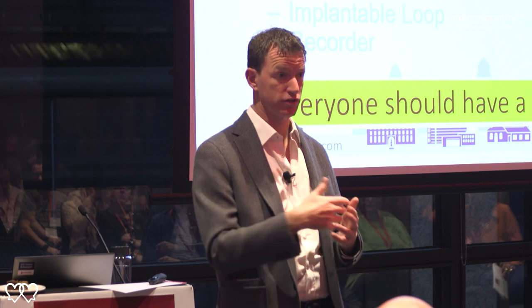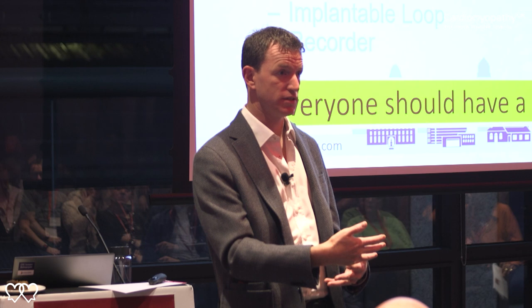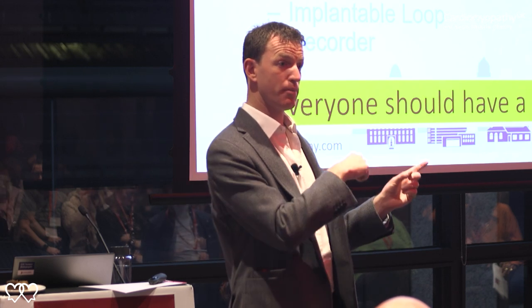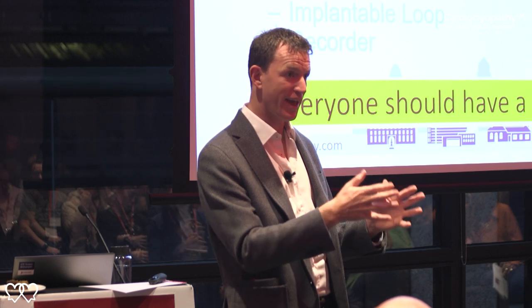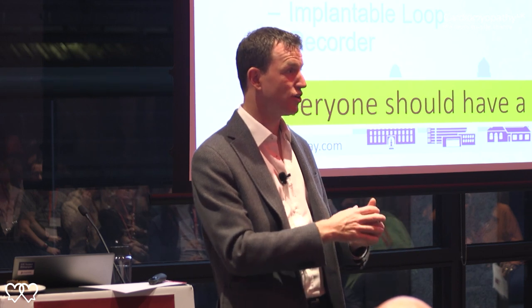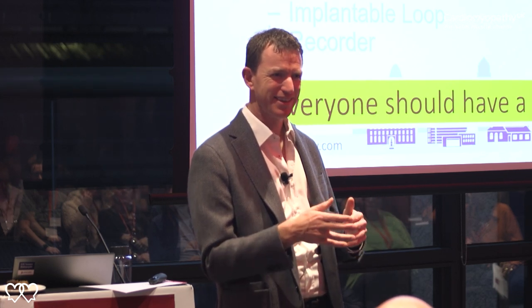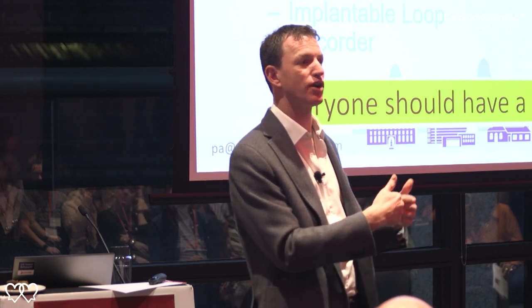And then the consultant will get a report with the example bits they've chosen to select. So even now, there's a bit of a manual process after the screening. You remember the implantable recorders I was saying? That was a huge problem to start with, because they are connected and they're listening all the time for 2 years. And so the false alerts have been maybe the biggest bugbear, because you don't want to get it wrong either. It's all fine to leave it to a machine to try and work it out, but you've got to have another screening thing.